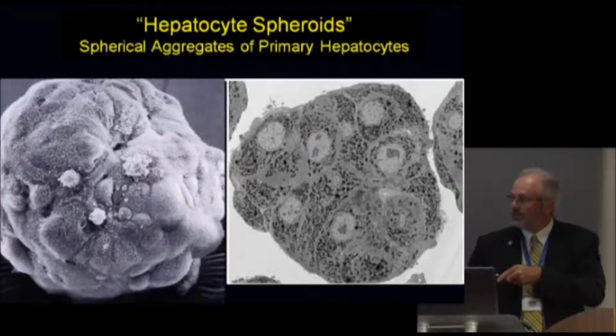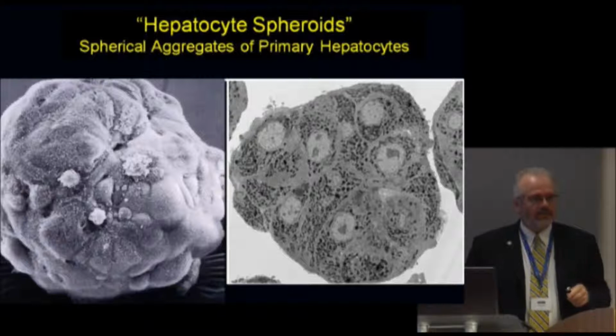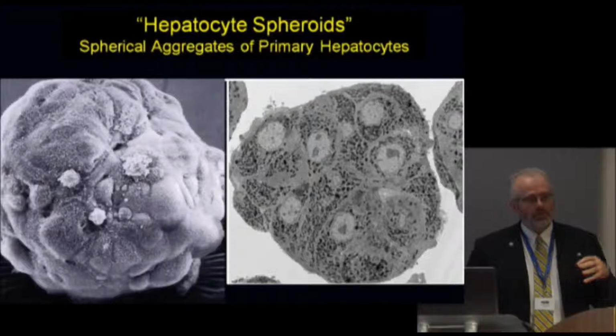The functional units are these spheroids of hepatocytes that are roughly 100 hepatocytes in aggregate mass, measuring about 75 microns in diameter. We've optimized this process over the past 5 to 10 years, so it's very reproducible that we have spheroids that look similar to this, that then are stable in culture for days to weeks. We've had reports in hepatology of 4 to 6 weeks in culture. The purpose of the device is really as a daily 24-hour treatment.